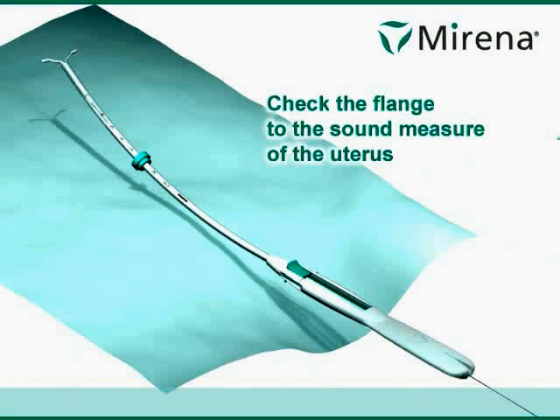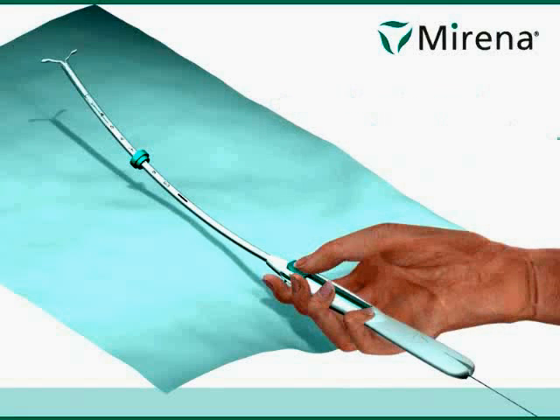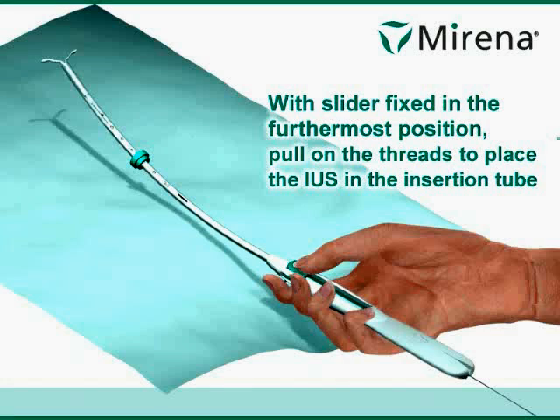Check the flange to the sound measure of the uterus. Check thumb position. With the slider fixed in the furthermost position, pull on the threads to place the IUS in the insertion tube.